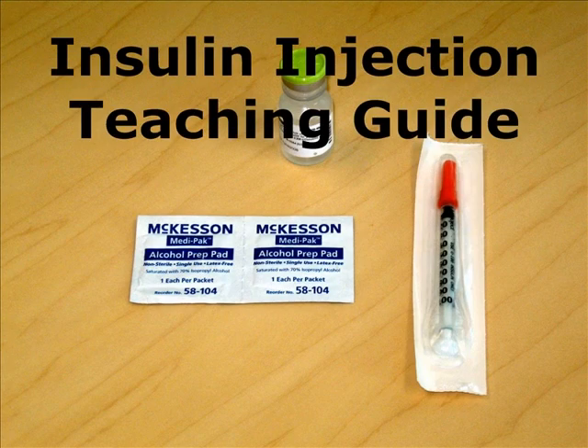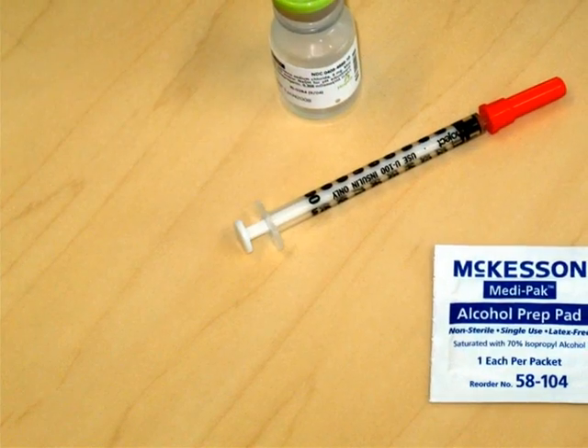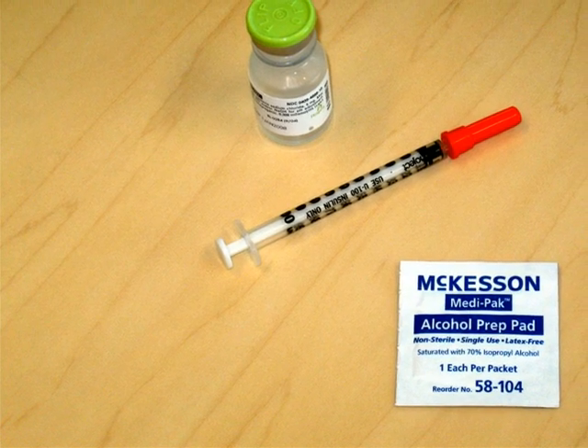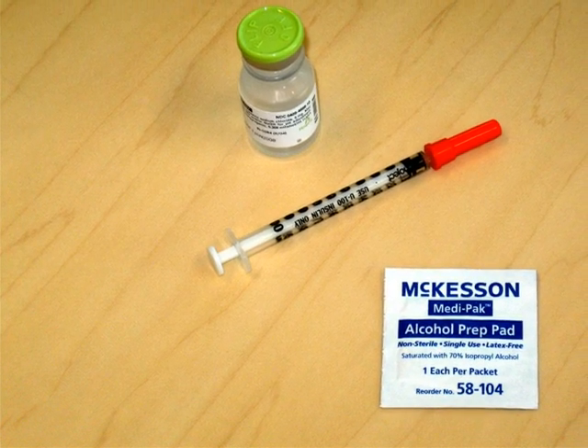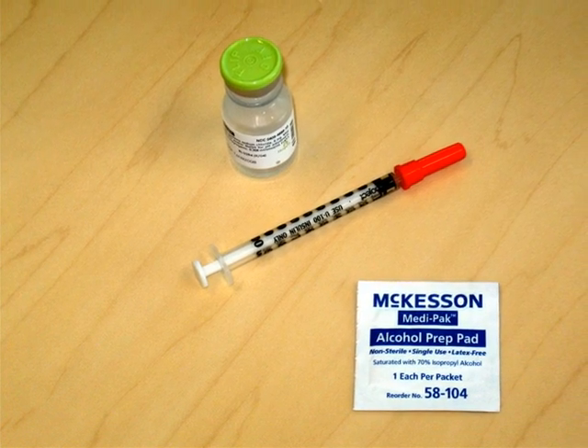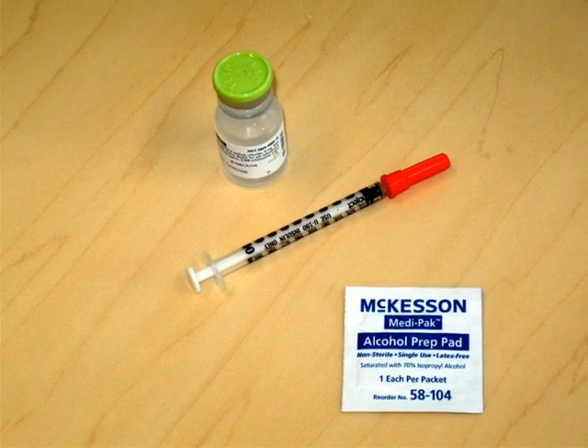Today, we're going to review the appropriate technique for insulin injection. This guide will walk you through the steps of insulin self-administration. The first step in insulin administration is to gather all of the items we will need together. These items include the insulin vial, a syringe, and an alcohol wipe.